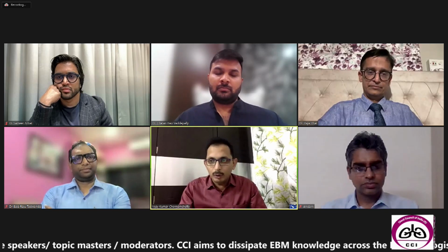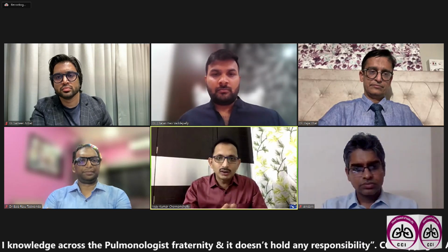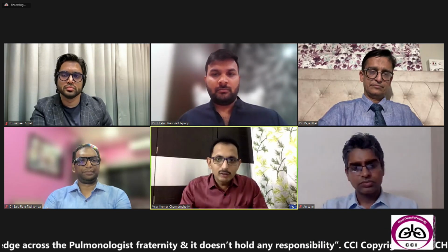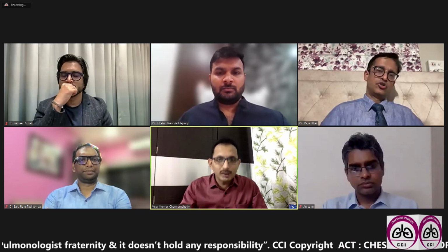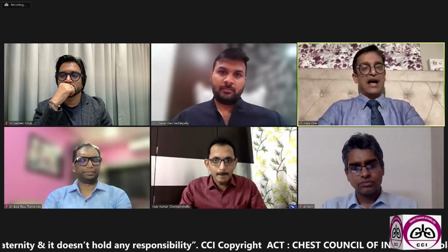But again, it is a very interesting point which you have made. In the sense, these fibrotic components, which we have to identify in the CT, as Chetan rightly mentioned, the HRCT gives a very good picture of where to biopsy. This is one area where if there is predominant fibrosis, we avoid taking biopsies, so that the chance of having a BPF is very less. So I agree with you.